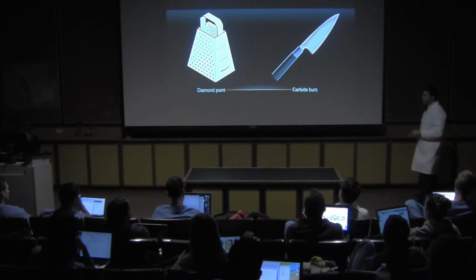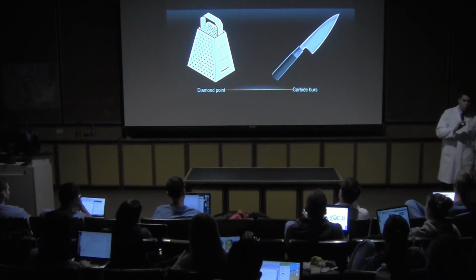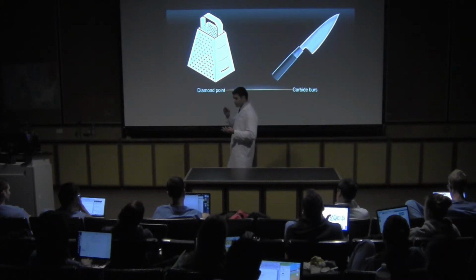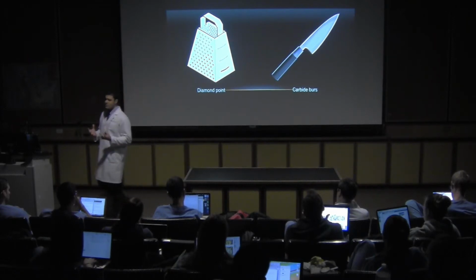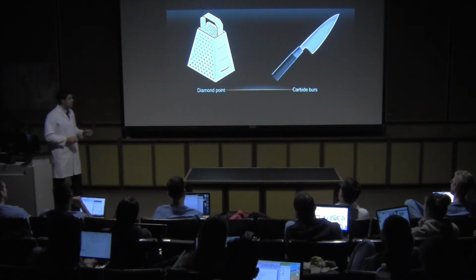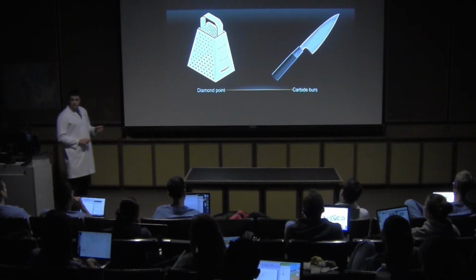And here, when we work, I want you to understand this because it's very important. It's a different concept from the class 1, class 2, and the size of the preparations are bigger. So, when we are going to work with this type of preps, we're not going to work anymore with carbide burs.